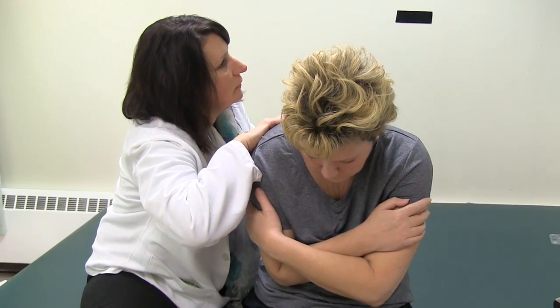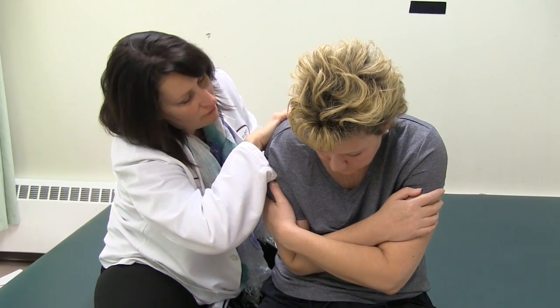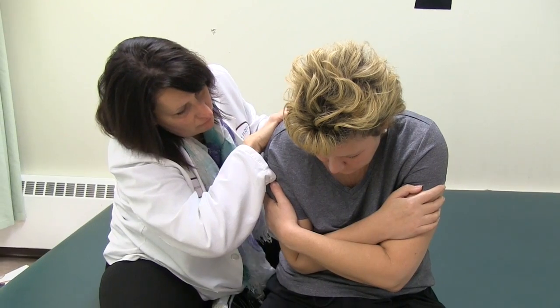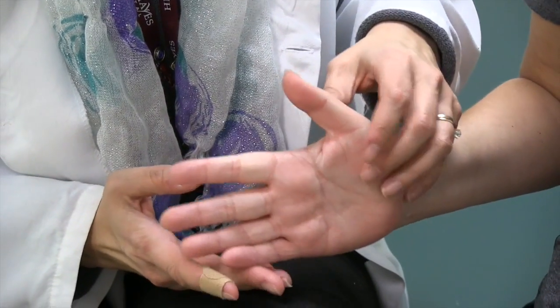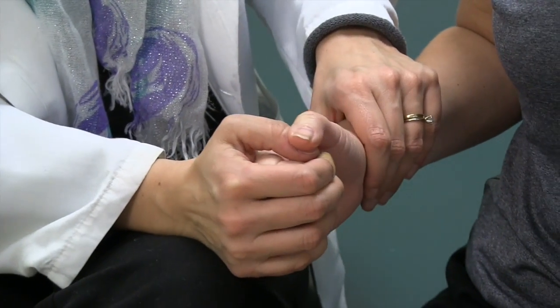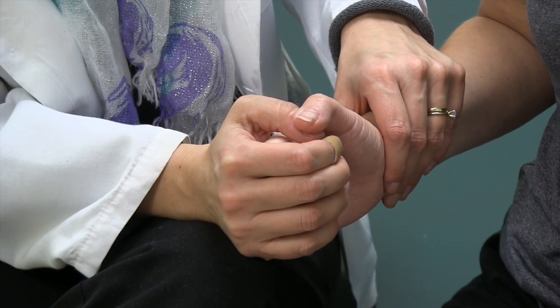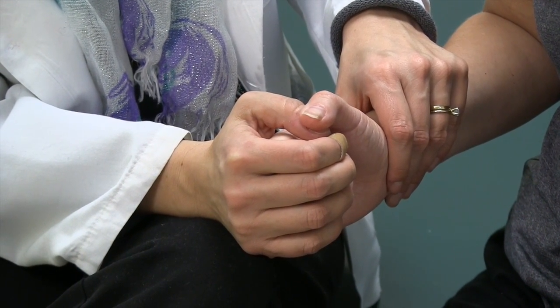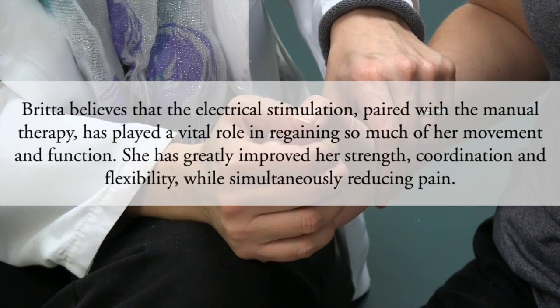What we're going to do next is start doing some stuff with your hand. I'm going to leave this stim on just so it's getting that retraction going on back here, but we're going to switch to doing stuff with your hand. Open all the way — good. Make a fist. I'm going to give a little stretch of that end range. Which fingers are you feeling it worse in? The middle finger.